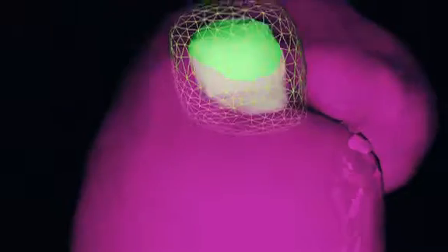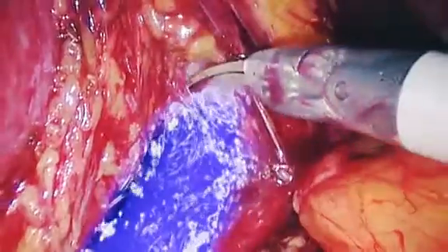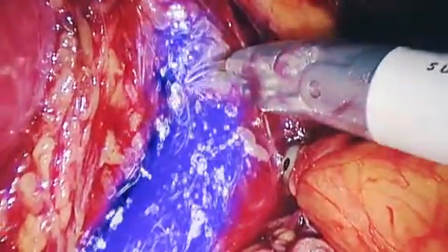We now have voice control, so the surgeon will be sitting in the console and using number control by saying 1, 2, 3, 4, we can bring up image enhanced views over the robotic console view for particular stages, such as you can say 1 and that would bring up the renal vessels and highlight exactly where they are. You can say 2 and that would then show you where the renal tumour is.